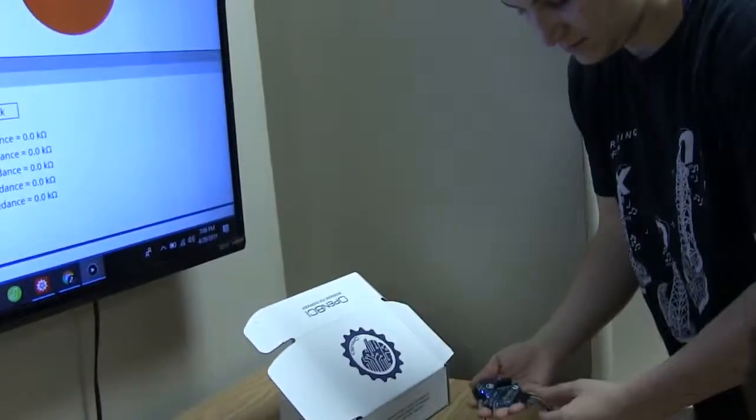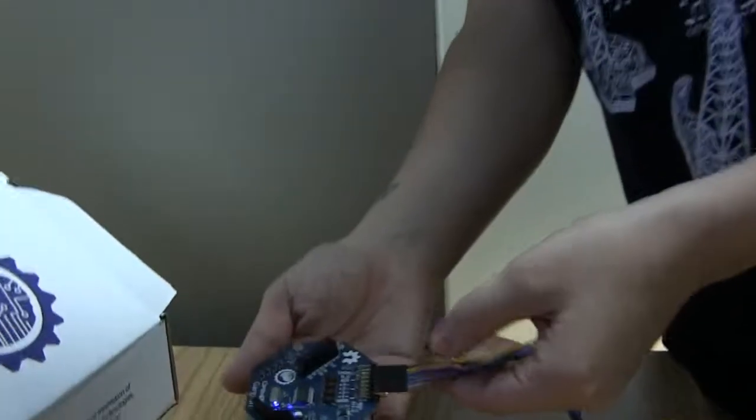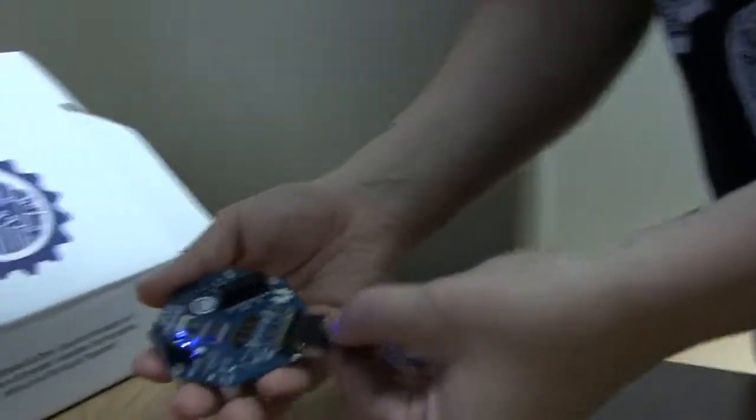We proposed a BCI that would aid children in the development of letter recognition, in which the sound of a letter will be spoken to them and they would have to attend to the right letter on the screen. We aim at accomplishing this by using a Ganglion brain-computer interface.